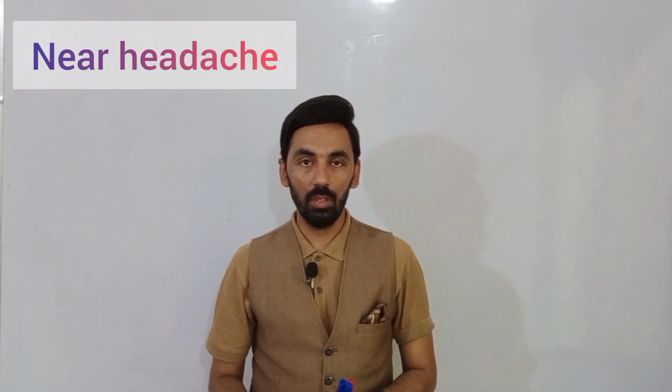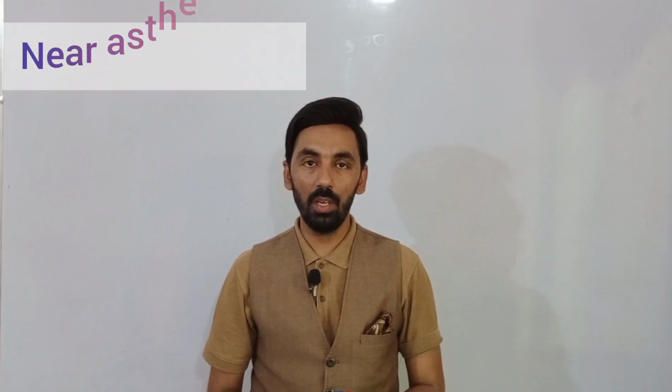The next is in every complaint of near work. If we find near headache, if the patient complains of near diplopia, near asthenopia, or any complaint in reading or writing, then we will perform dynamic retinoscopy.